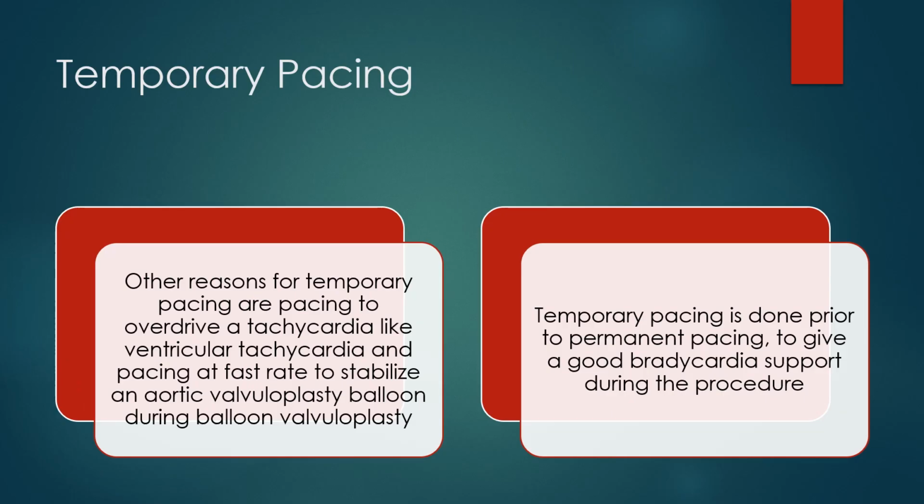Other reasons for temporary pacing are pacing to overdrive a tachycardia like ventricular tachycardia and pacing at fast rate to stabilize an aortic valvuloplasty balloon during balloon valvuloplasty. Temporary pacing is done prior to permanent pacing to give a good bradycardia support during the procedure.